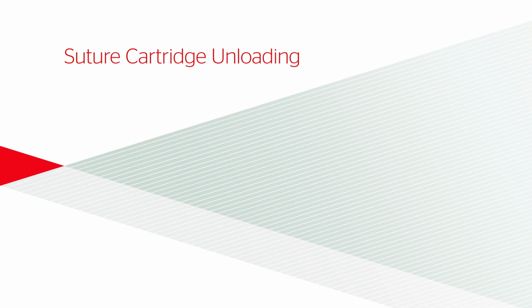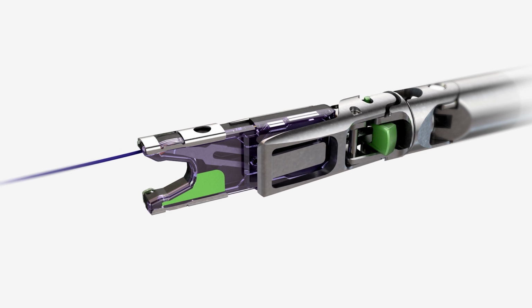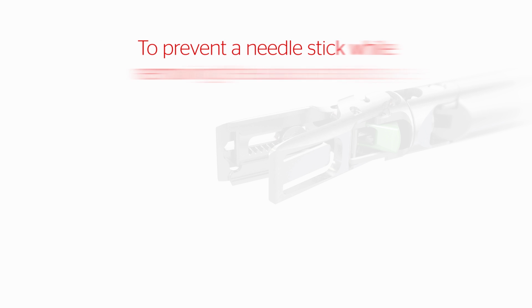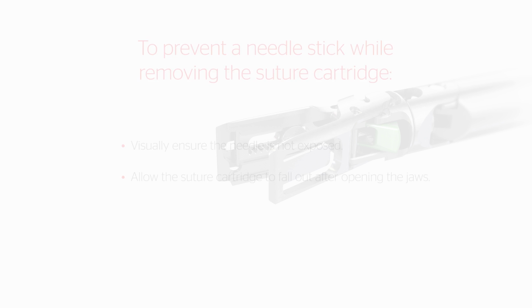Suture cartridge unloading. Move the green suture cartridge release lever back toward the handle to open the jaws and release the used suture cartridge. To prevent a needle stick while removing the suture cartridge, visually ensure the needle is not exposed. Allow the suture cartridge to fall out after opening the jaws.